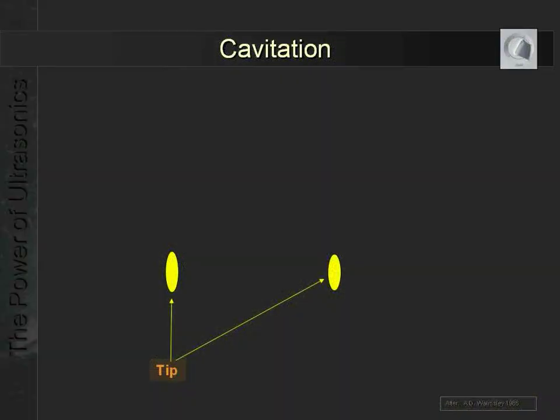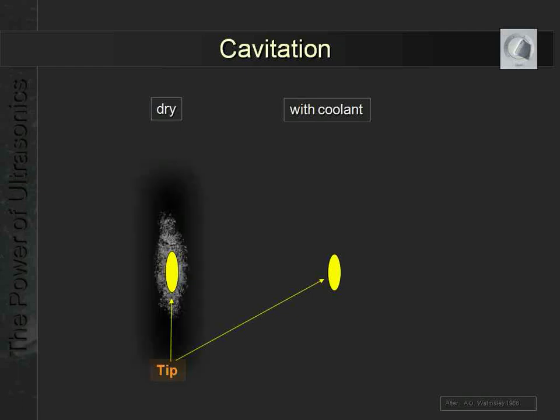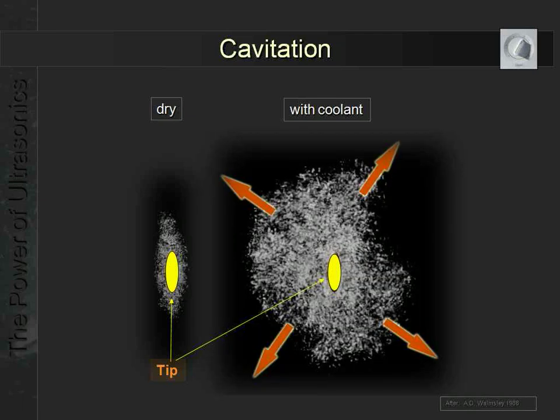Well, you can work with the tip dry, so without coolant, or you can add the coolant. If you work dry, this is what the effect will be. This is the mechanical effect of the tip going over the surface, going mostly back and forth and a little bit to the side. But if you then add the coolant, this is the effect that you get. So you get more out of treating with an ultrasonic unit and water coolant. And before you go home and think you can do this with calculus, this was a study performed with biofilm, with plaque. So when you have biofilm removal, the cavitation effect might help you. And probably when you've worked in patients where there's a lot of plaque on the surfaces and you start treating, you'll see that it's almost removed beyond the tip. So you get a lot more effect out of the coolant.